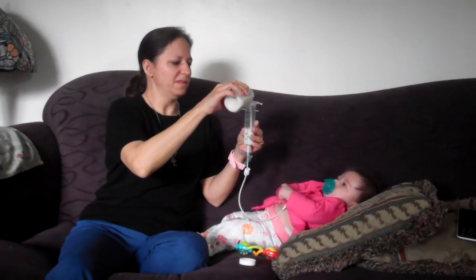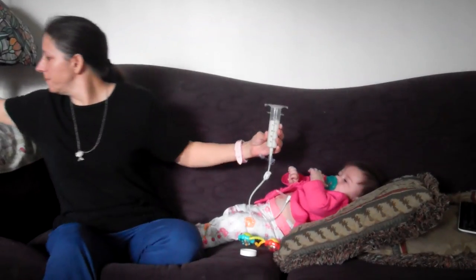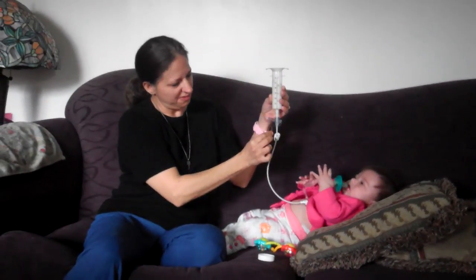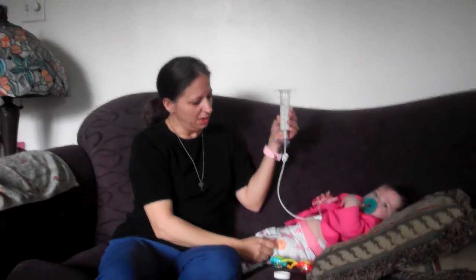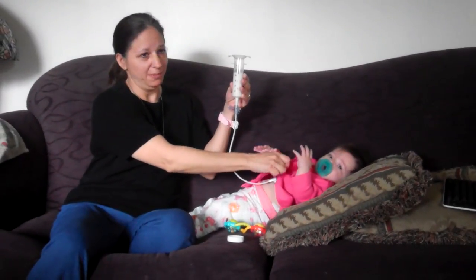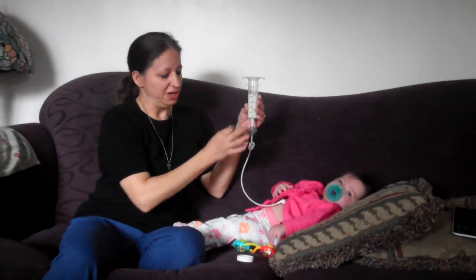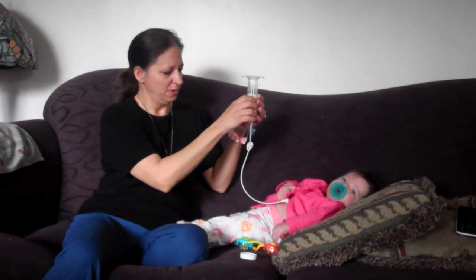So I'm going to pour some in here. I don't always like to fill it all the way up, because if they have air in their tummy, now I unclamped it, so now it's going to start going down. If she has air in her tummy, you'll see air coming up out of here, and that's all right. Sometimes you may see maybe some of her vitamins or something brown coming up. It doesn't matter what comes up out of there. You can just leave it there and let it go right back down, because that's where it came from. That's what her doctor told us.